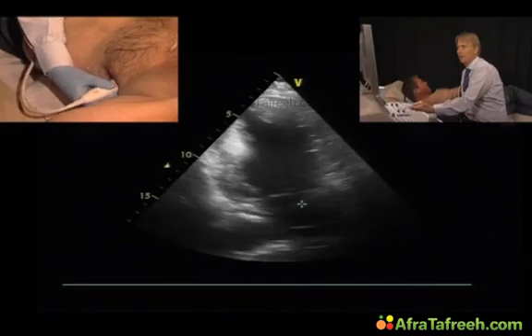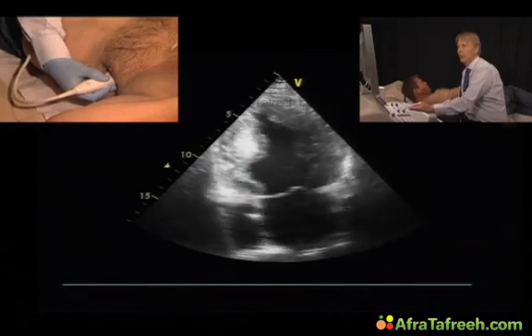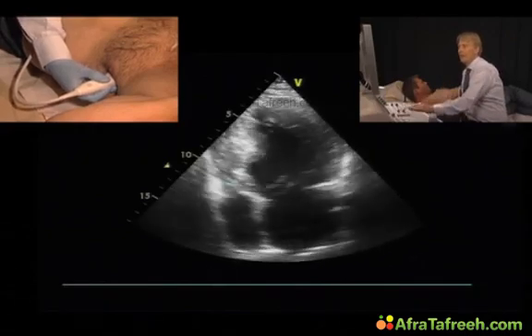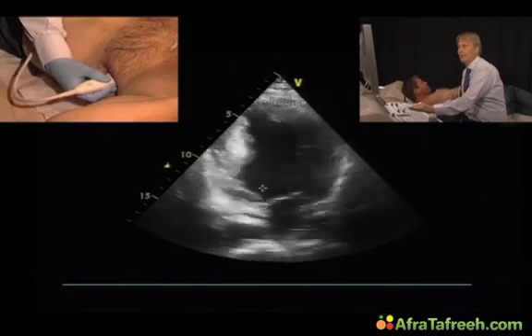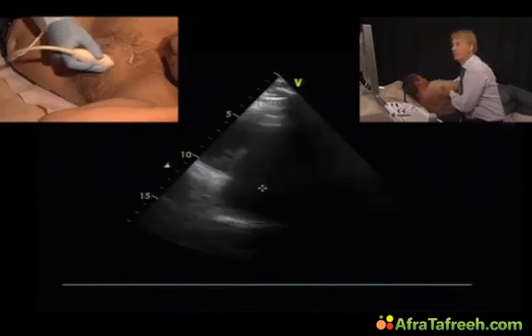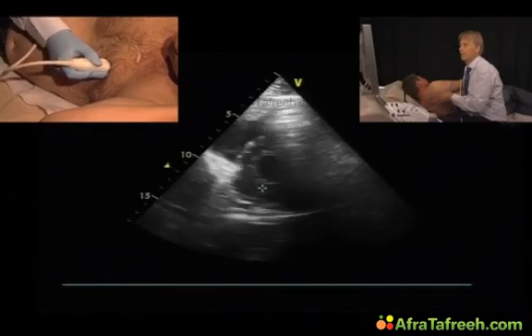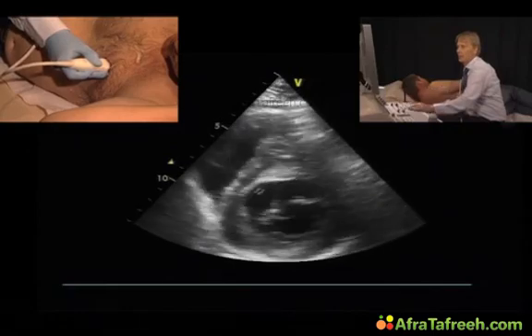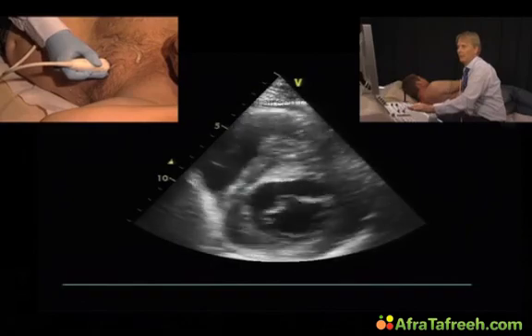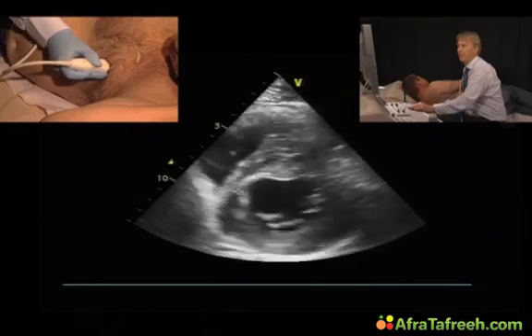And if we go into the two-chamber view, we can also appreciate that here in the two-chamber view, and the wall motion is also abnormal here. It's akinetic in this region here of the basal inferior wall. And if we take a look at the short axis view, this is the short axis view. This can also be noted here. So, basal inferior septum, wall motion abnormality, thin myocardium.